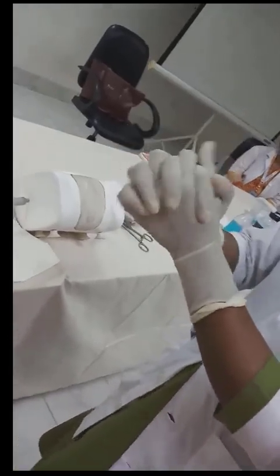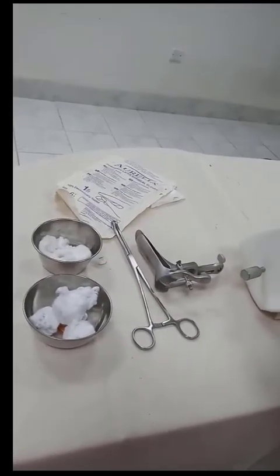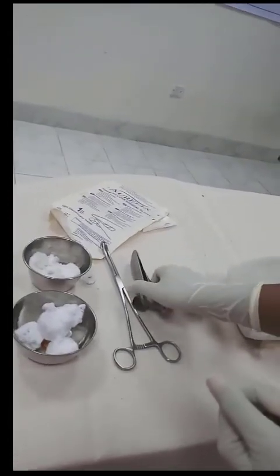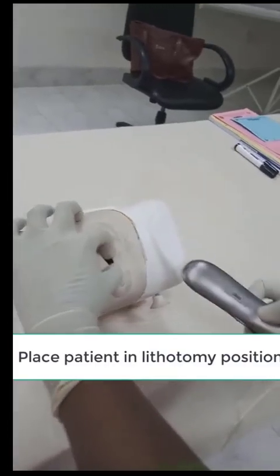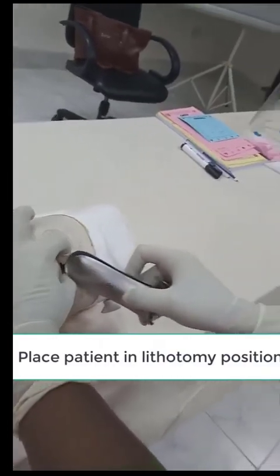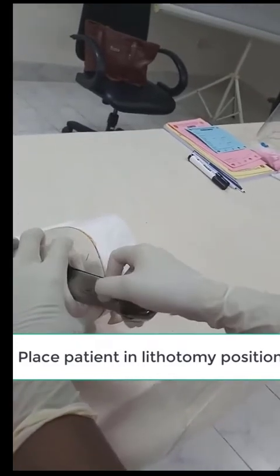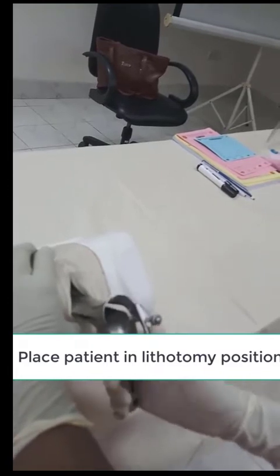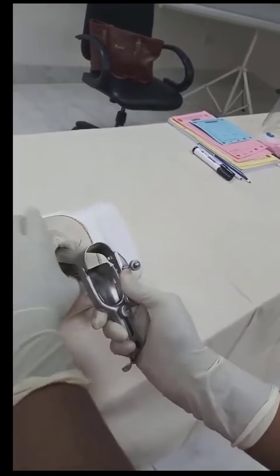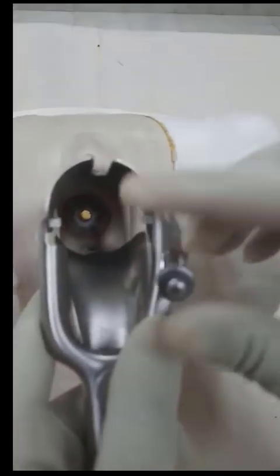Here the examination is shown on a model. Then the Cusco speculum is introduced through the opening of the vagina. The speculum is directly introduced so that the whole cervix can be visualized, and then it is locked.